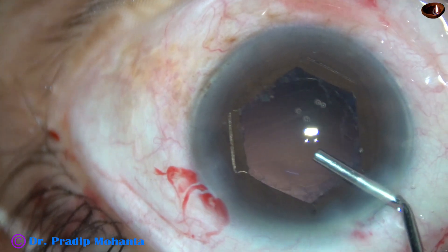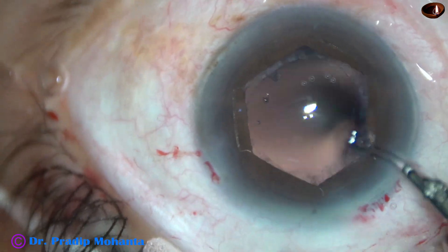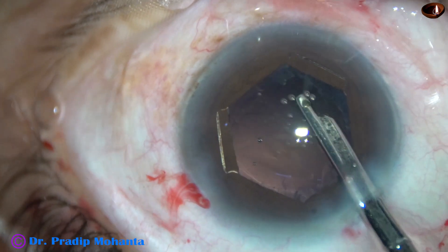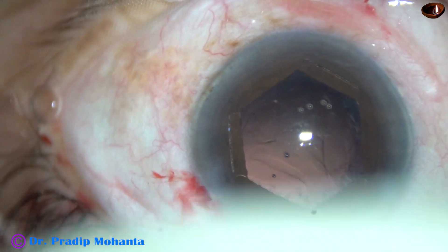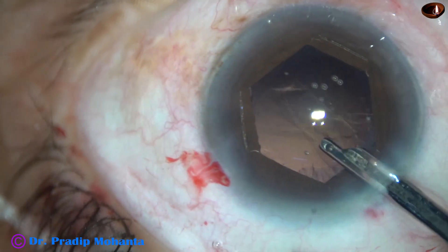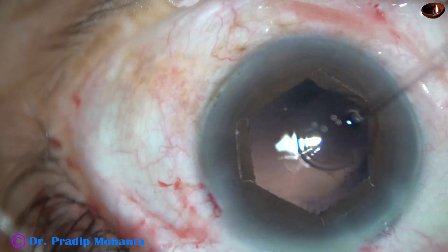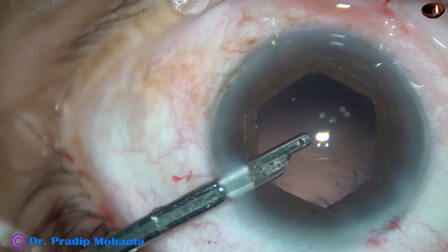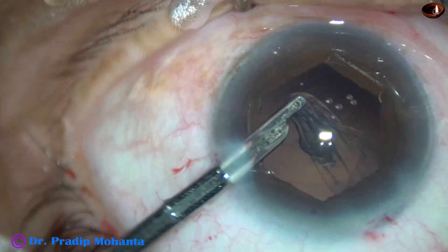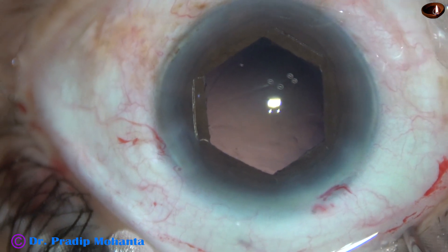Now we are going to remove the cortex. The capsular bag and anterior chamber is filled up with viscoelastic. I am using a 23G Simcoe cannula for removing the cortical lens matter. This is almost done. Go through the side port and remove the sub-incisional cortex, and the cortex at 10 o'clock. The cortical clean-up has been very satisfactory and the posterior capsule is very clear.